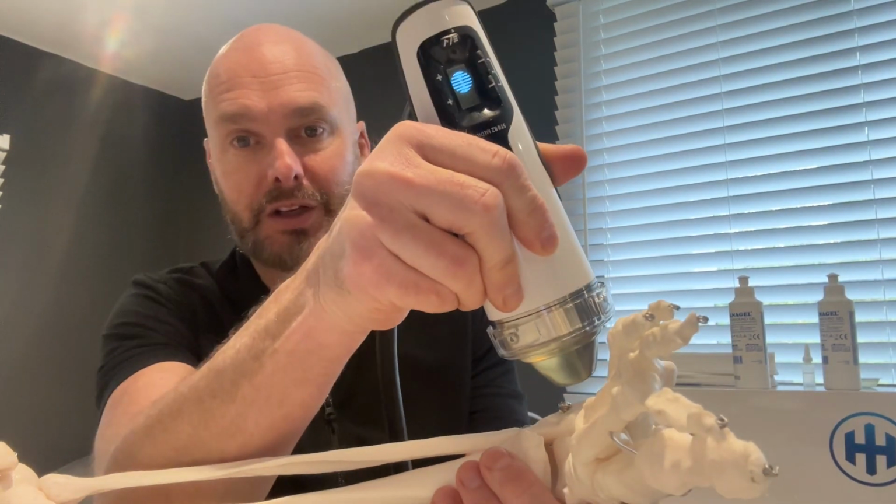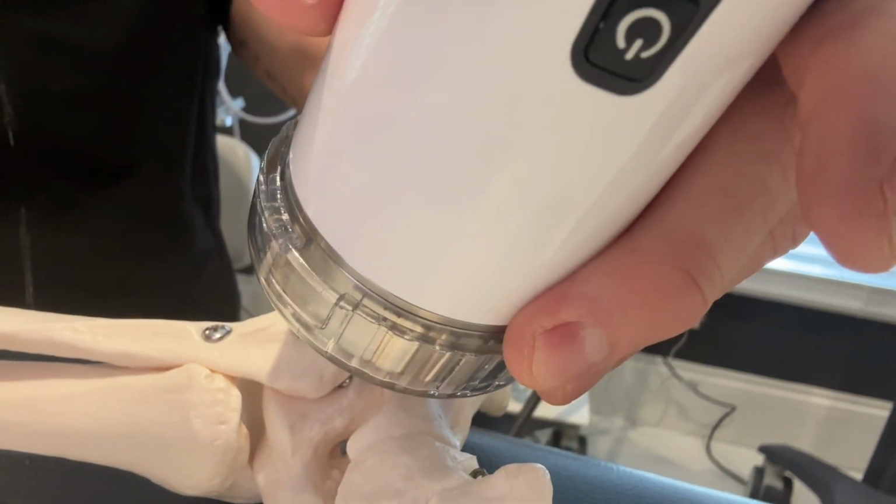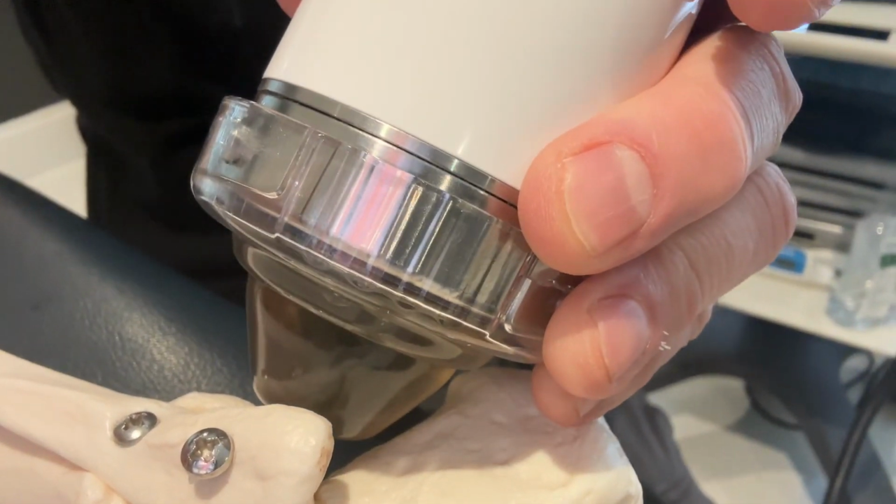Now, when you have the focus device, all of a sudden we've got a great deal of options. So a nice big blob of gel. Obviously we're going to use the bigger standoff because it's so superficial, and we can work directly onto that ATFL straight there, no problem. CFL as well, we can go straight onto there. Now, how we're going to do that is determined by the extent of the injury and the stage of the injury.